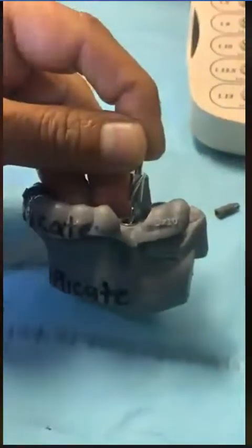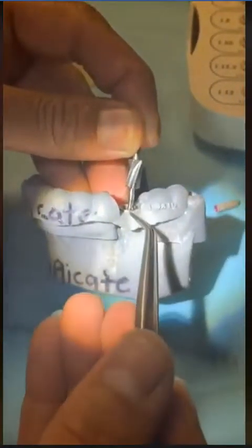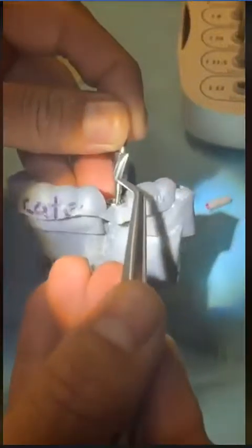Take a look. Will I get the benefit of the guide at this point? Because in order for me to get a full benefit, look how much I have to go, because this is the area that actually engages into the tube, the master tube.